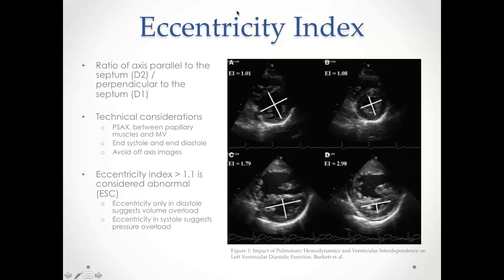Here is a picture of a normal example on top — this is from a pediatric patient so the cavity size looks small, but the concept is the same. On the bottom is a patient with pulmonary hypertension who has a clearly elevated eccentricity index: at end diastole it is 1.79, and at end systole it is approximately 3. Measurements should be done between the level of the papillary muscles and the mitral valve, in both diastole and systole, and off-axis images should be avoided.